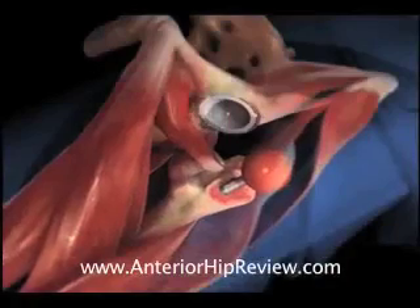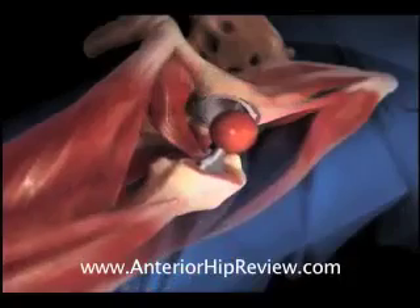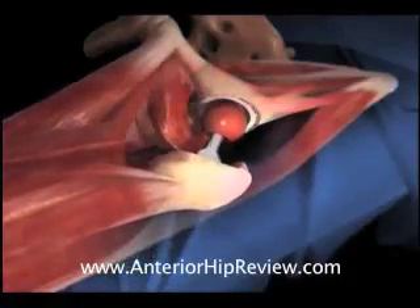At this stage of the operation, we check to make sure that the final fit and fill of all the components is appropriate, the trial components are exchanged for the final implants, and the hip is reduced and the incision closed up.